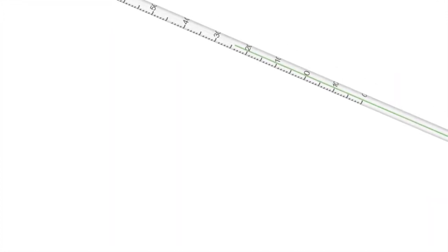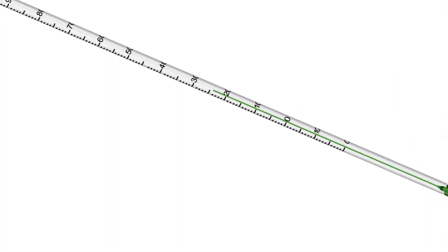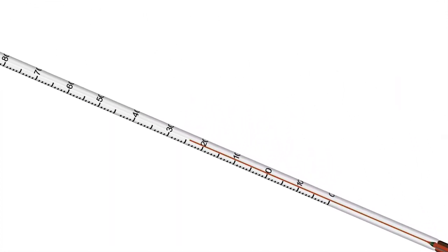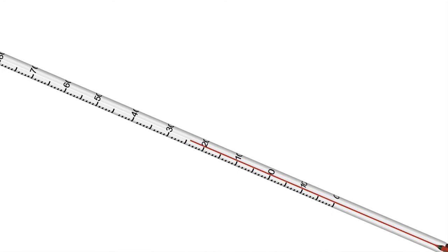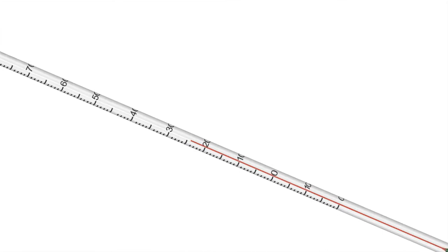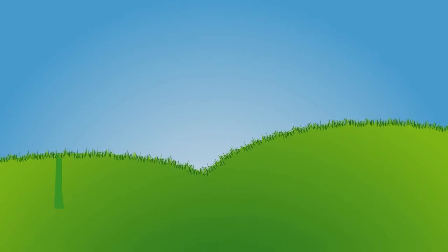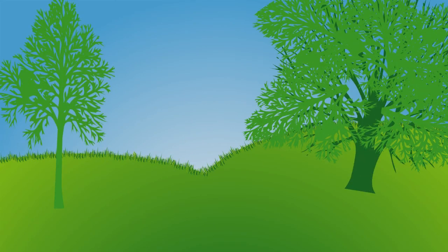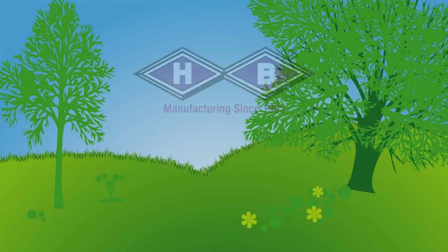When you buy a thermometer the color of the liquid may not be an indication of the type of liquid the thermometer's filled with. When you buy an HB Instrument Company envirosafe thermometer, you get the safest and most accurate non-mercury alternative on the market.